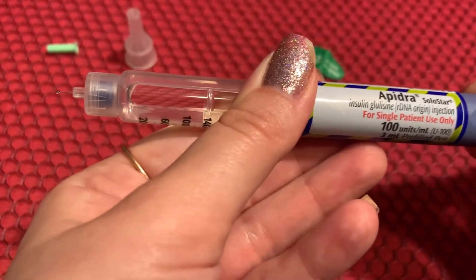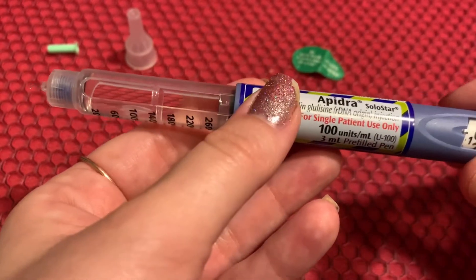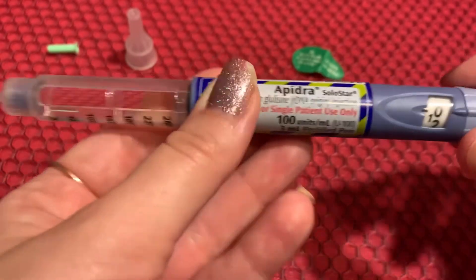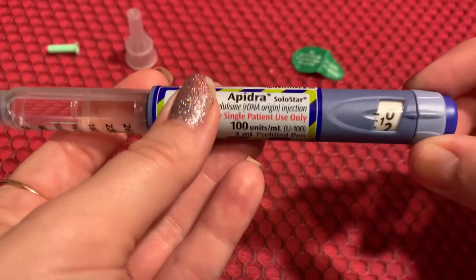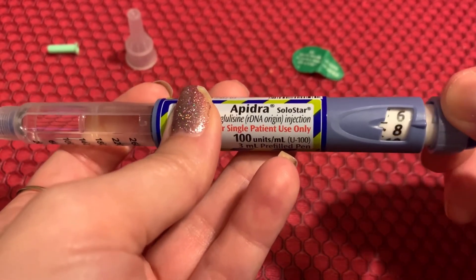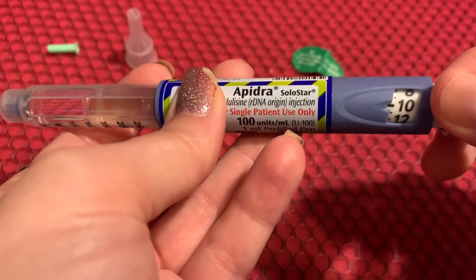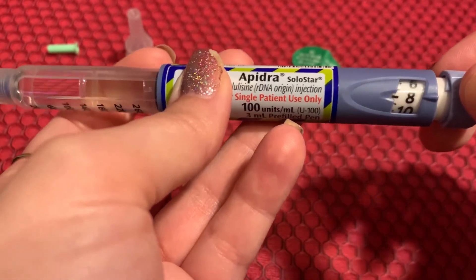If there is not insulin coming out of the needle, try putting another needle on — it may have been put on too loose or crooked. Or you may have a defective pen and will need to contact the manufacturer for a new one. Once you've primed your insulin pen, dial up your dose. So let's say you want to take eight units — you can see we've dialed it up to eight. If you want an odd number, it's just in between the two even numbers there. Pretty self-explanatory.